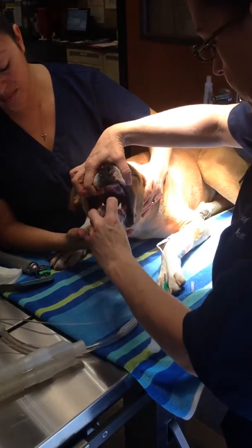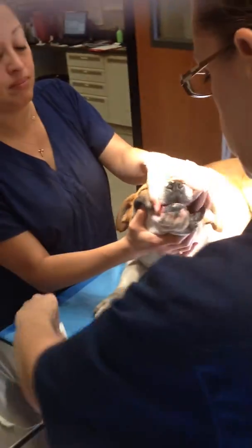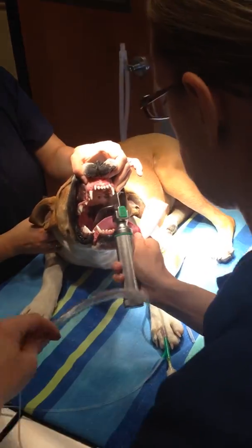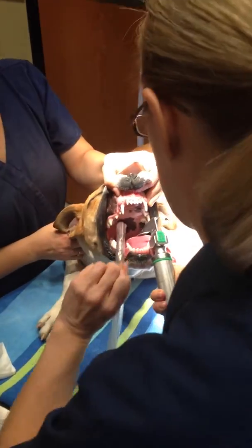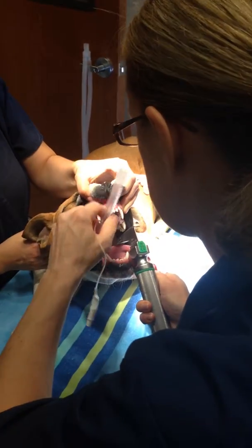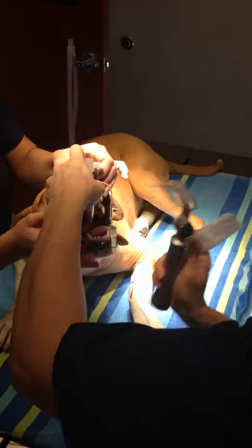Now it's nice and loose, so you hold his head up. We're gonna place the endotracheal tube into his trachea so that we can administer oxygen and gas anesthesia while he's undergoing his procedure.